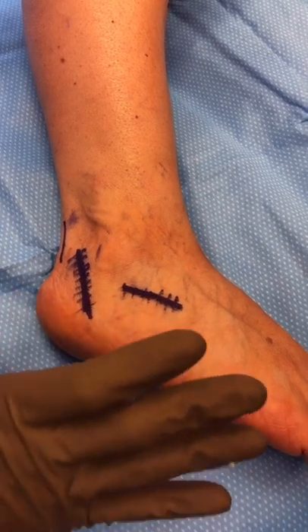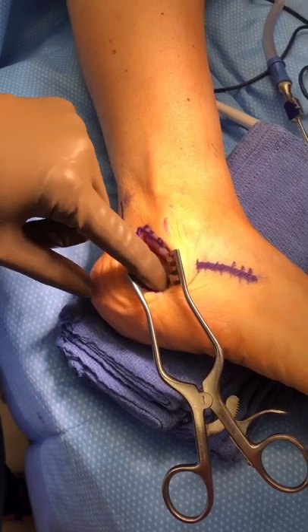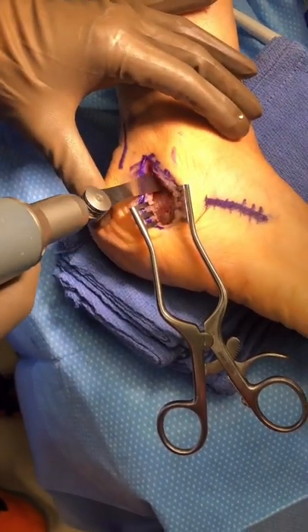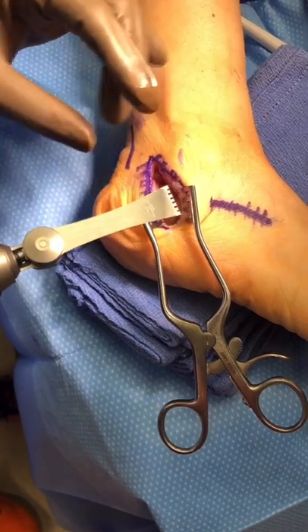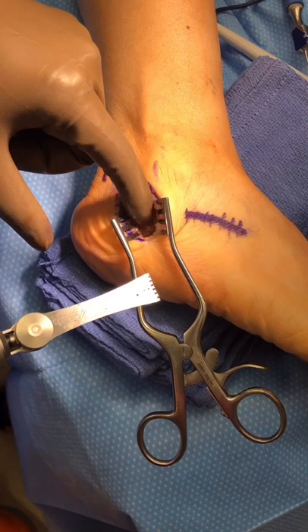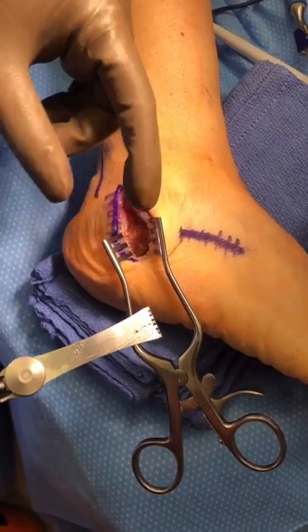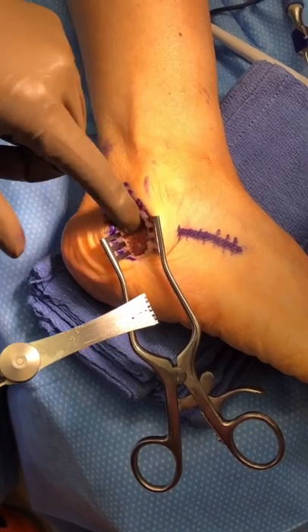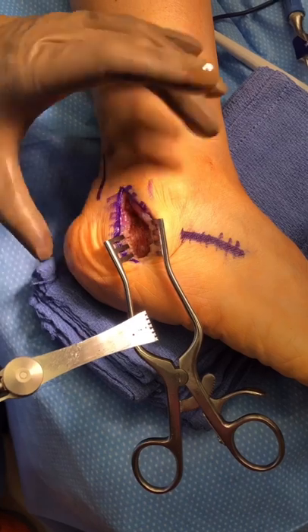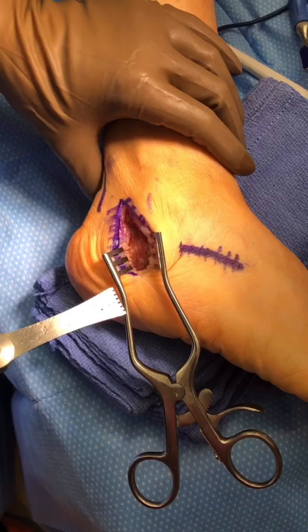Here you can see the calcaneus. We made a mark where we're going to cut it, and using this saw blade we're going to cut that bone all the way through, almost to the other side, then open that part of the bone by spreading it. We will then shift it over and place a couple of screws to hold that bone in correct alignment.